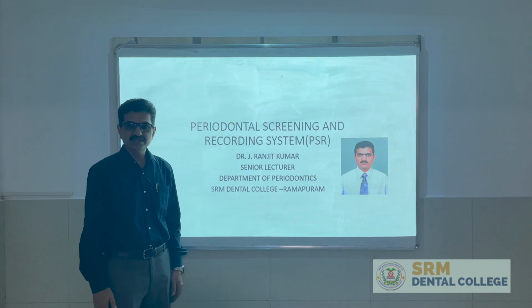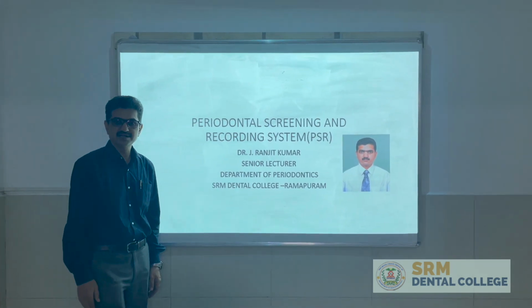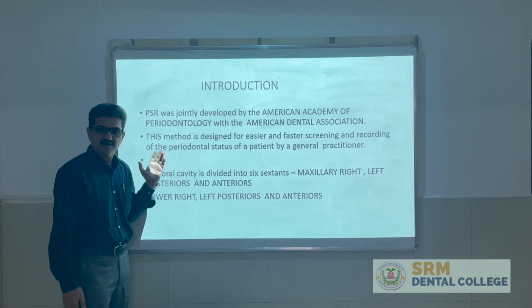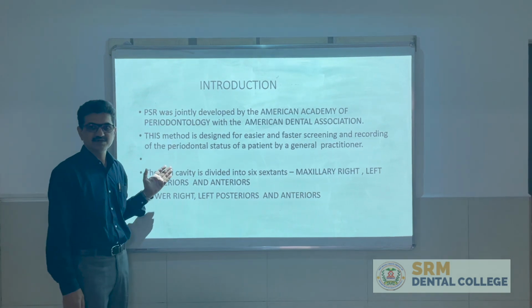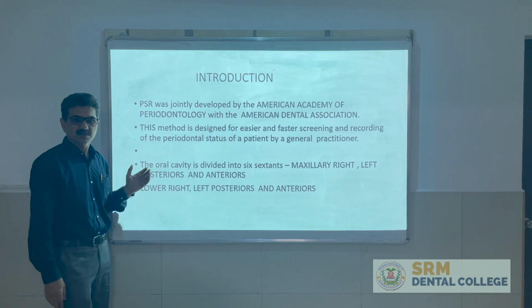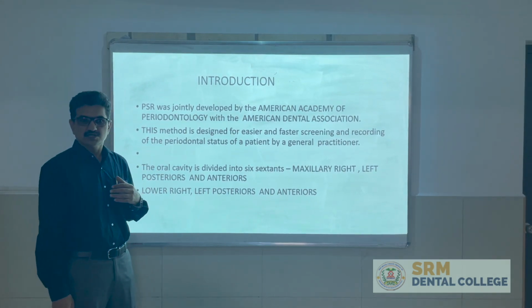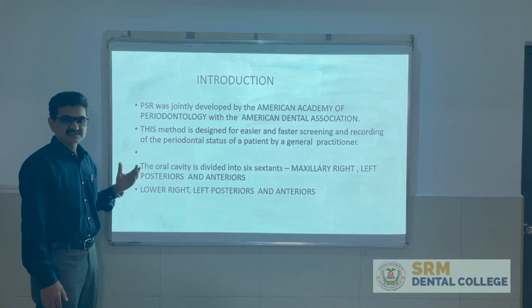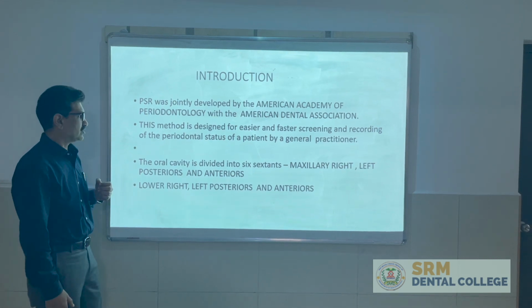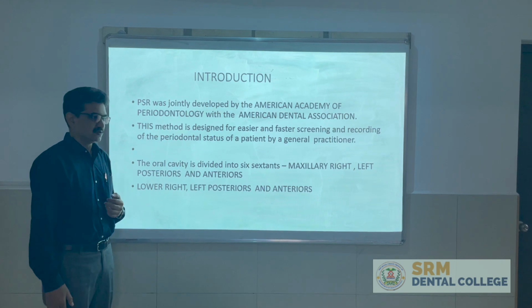Today my topic will be on PSR. PSR is nothing but Periodontal Screening and Recording System. PSR was given by the American Academy of Periodontology along with the American Dental Association. It was designed for easier and faster screening and recording of the periodontal status by general practitioners.